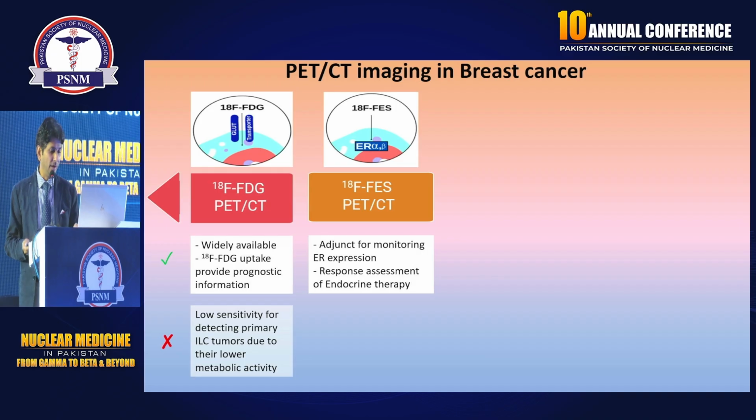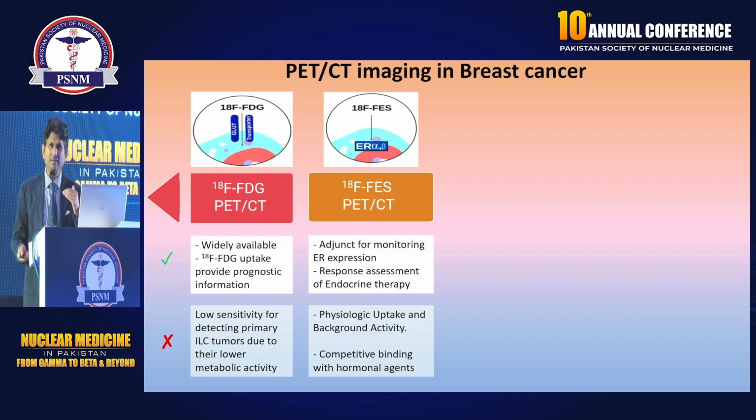So it's very good, but there are some limitations: physiological uptake is seen, and there is a lot of background activity. And there is some competition: if you are giving hormonal therapy, you have to stop certain hormonal therapy for a certain period of time, sometimes 6 weeks as well.